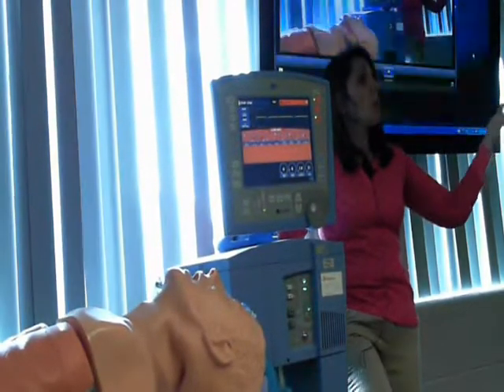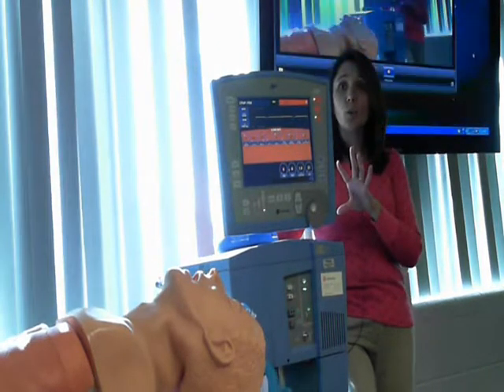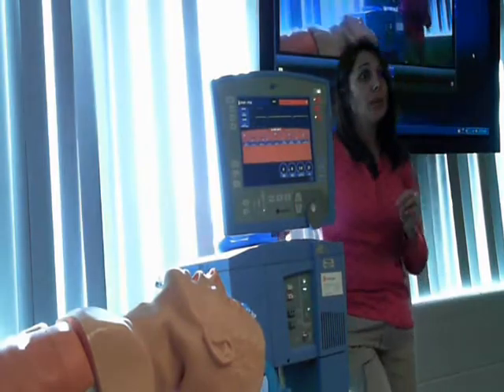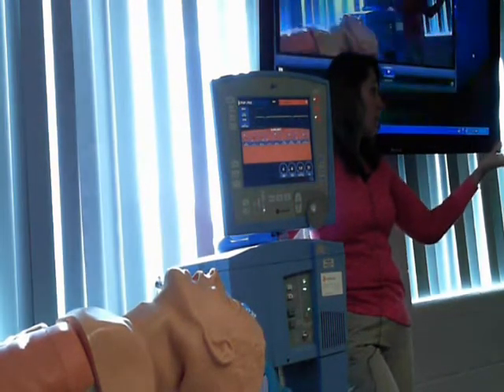And that's a very good question. What you need to do is talk to your therapist and see if it is possible to increase the patient's mandatory rate on SIMV.